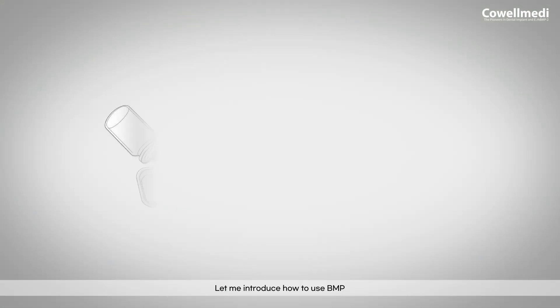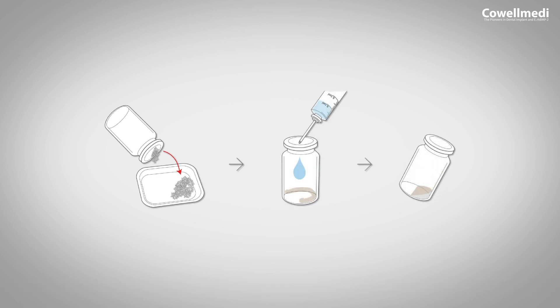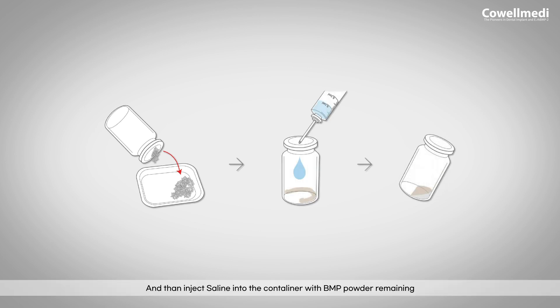Let me introduce how to use BMP. Transfer synthetic bone particles into a container, then inject saline into the container with BMP powder remaining. You need to mix them in a suitable ratio.